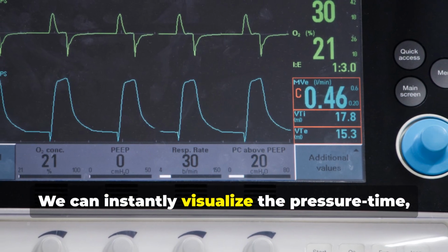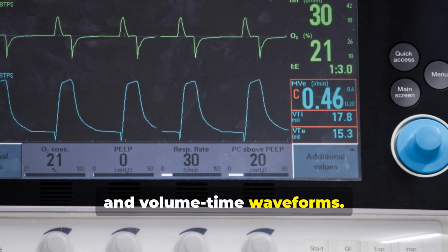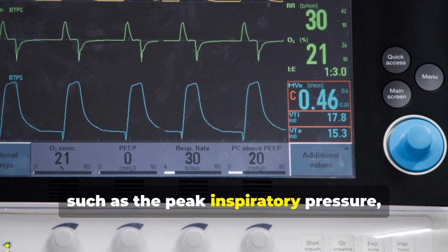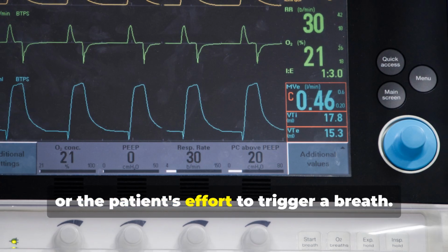We can instantly visualize the pressure time, flow time, and volume time waveforms. These graphs reveal critical details about every single breath, such as the peak inspiratory pressure, the presence of auto-PEEP, or the patient's effort to trigger a breath.